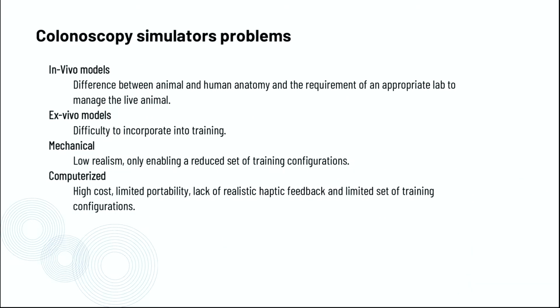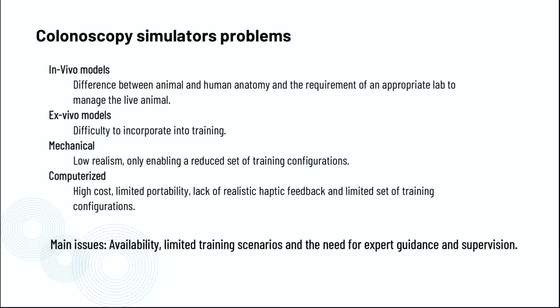Despite the benefits of using colonoscopy simulators being more apparent over the last decades, each category has its own drawbacks. Issues about availability, either because of time, space, or cost limitations, the reduced sets of training scenarios, and the need for tutelage during training are the main issues of current simulators.